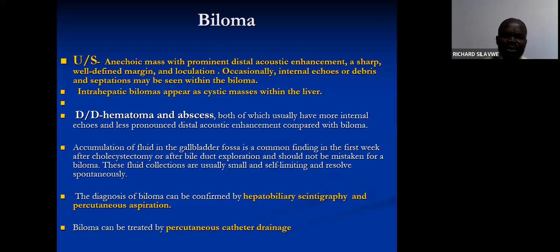Accumulation of fluid in the gallbladder fossa is a common finding in the first week after cholecystectomy or after bile duct exploration, and it should not be mistaken for biloma. These fluid collections are usually small and self-limiting and they resolve spontaneously. The diagnosis of biloma can be confirmed by hepatobiliary scintigraphy and percutaneous aspiration.